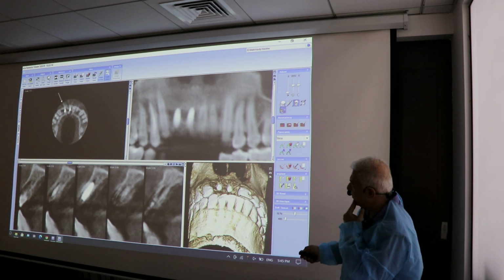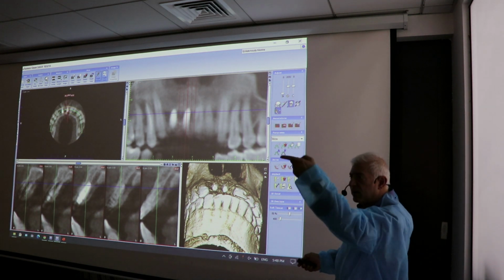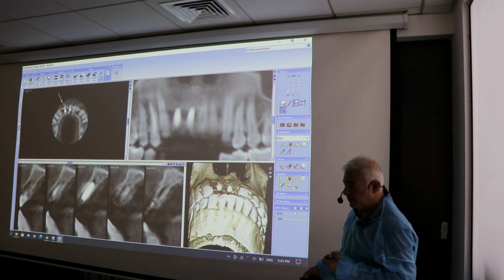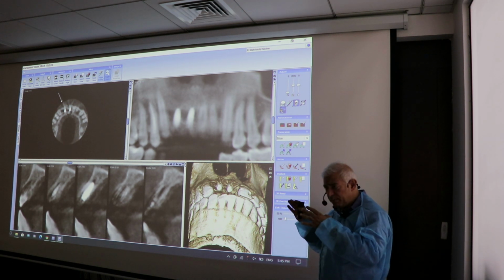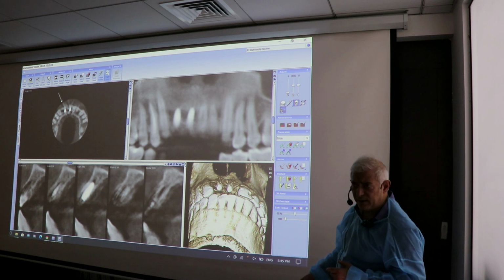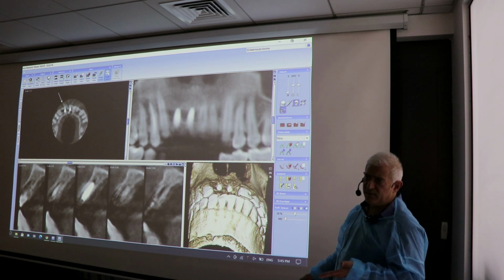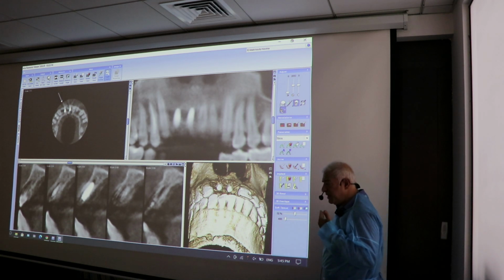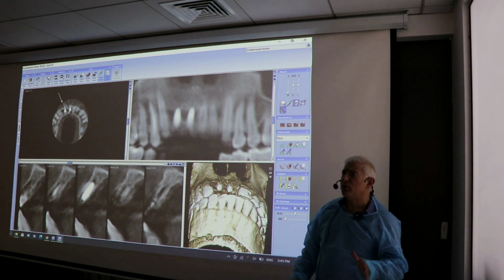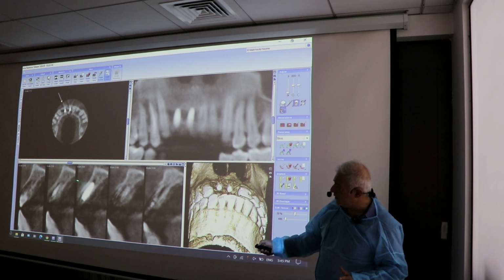All right. So this is the position of the implant. This is the second one. We had a discussion, Reem, yesterday. You were worried about the palatal bone. Between the bad and the worst, I will always take the bad. This is not perfect palatally, right? What is worse? Buccally. So I chose the bad versus the worst, because the palatal gingiva is so hard and so thick, and the periosteum is so thick, that there is a good chance that I will not lose anything on the palate. I will only lose on the buccal. So I wanted this thickness on the buccal.